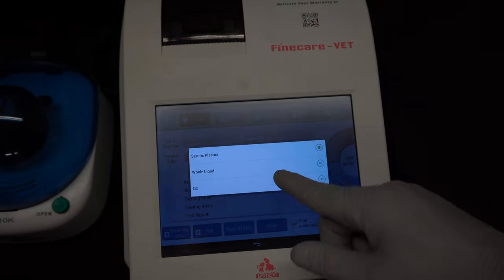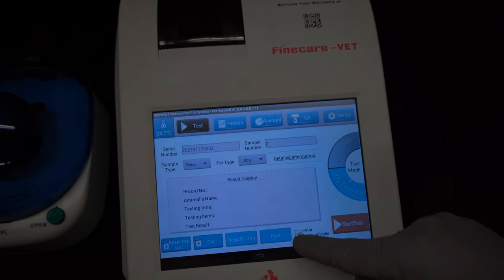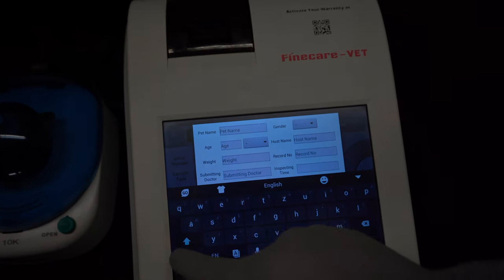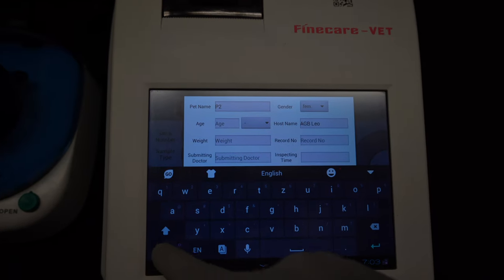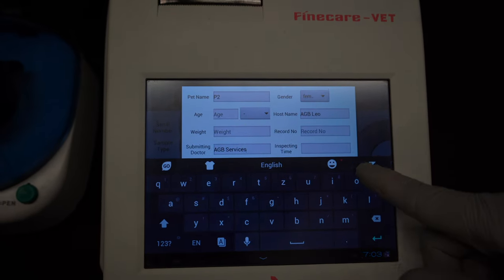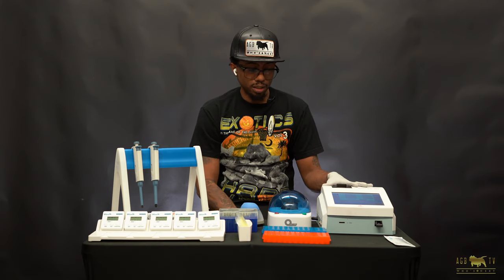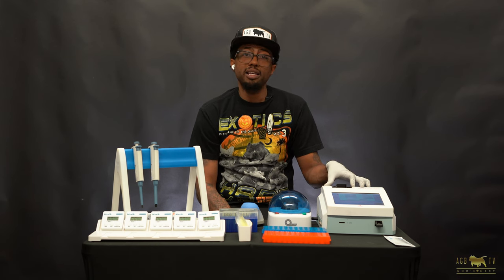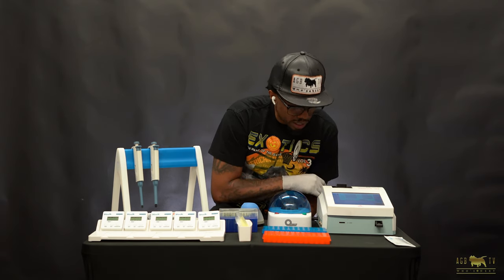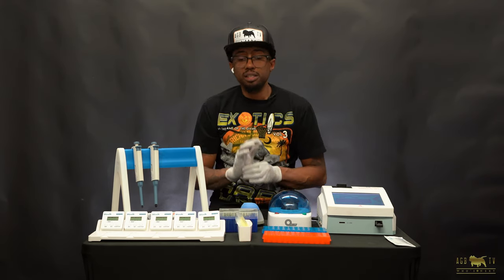Go ahead and click serum and plasma. In this case we'll be testing a dog, then proceed to detailed information. What I like to do with the detailed information is put the pet's name, the owner's first and last name, and who's running the test — AGB Services. One of the reasons I do those things is because if you lose the slip I give you, I can go back and print it at any time. This machine can store over a thousand tests and you can always go back and print results from a previous test. Make sure you put the pet's name, the owner's name, and hit yes to save.